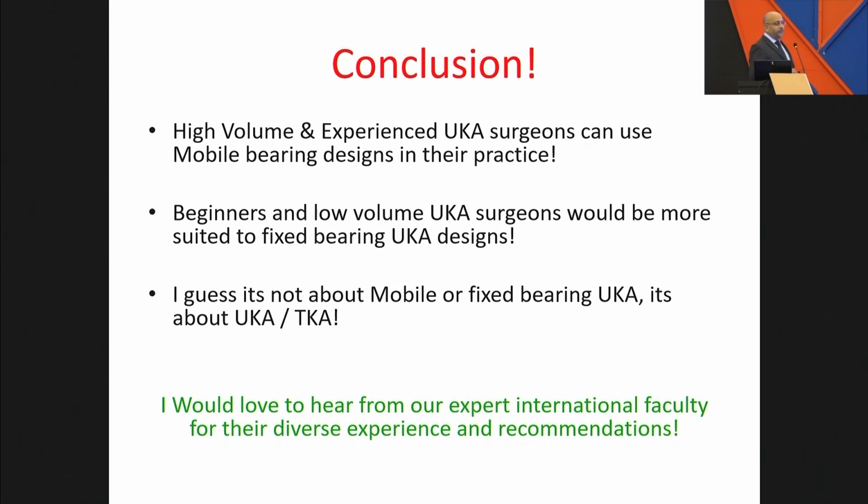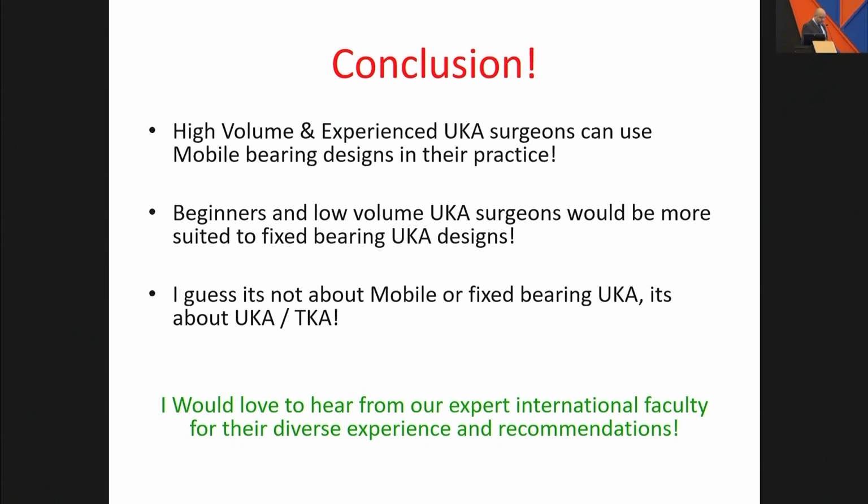But for somebody who is a beginner, who is handling the instruments with a little bit of a challenge, he should probably start off with a fixed bearing design. And as discussed with Epton, if you look at the two designs, it's probably not about mobile or fixed bearing. It's the decision of whether you want to do a unicondylar knee arthroplasty or a total knee arthroplasty. So again, I appreciate our shortcomings in terms of experience, and I would love to hear from these knee surgeons who have come around to Pakistan to enlighten us about this.